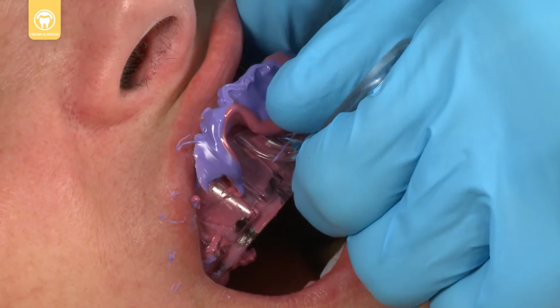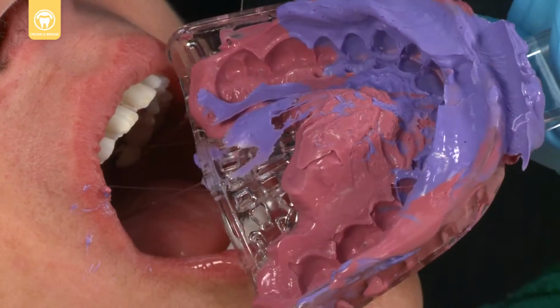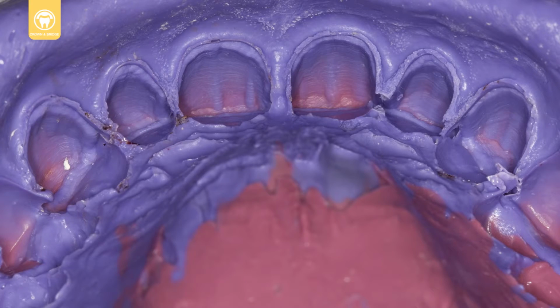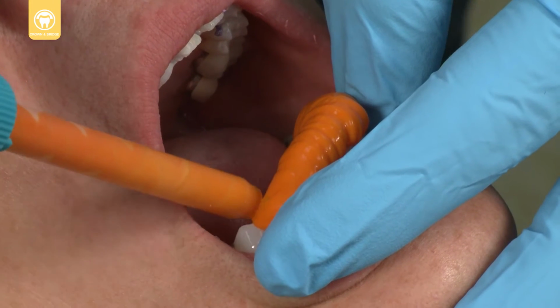Leave the tray in the patient's mouth until the material is fully set. After it has set, remove the tray. Check the margins and preparation for air or saliva bubbles. After the final impression is inspected, remove the second retraction cord. Use Clone Bite to make an accurate impression of the bite registration.